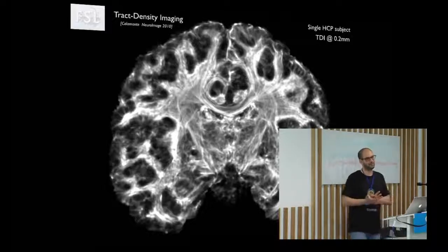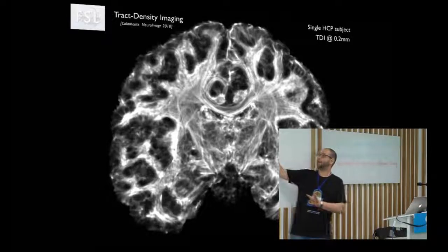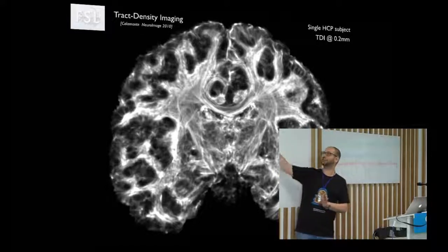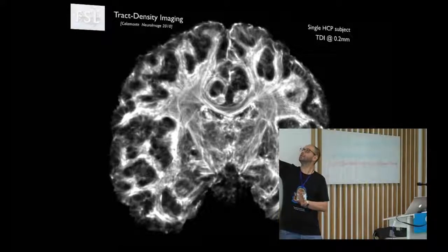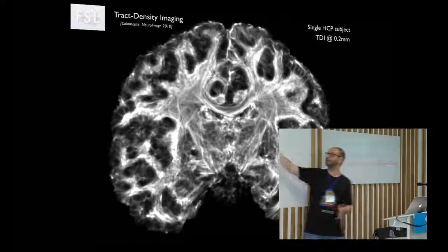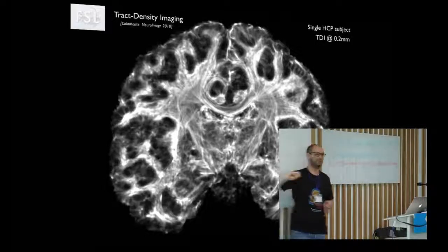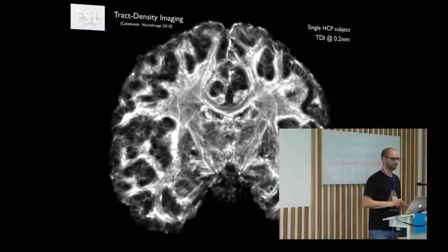But even if you do this rather simple approach, it's going to act like a sort of super resolution algorithm. Given exactly the same structural connectivity mapping that you performed at the beginning, you start seeing the crossing of the white matter fibers at a much higher resolution, with the corticospinal tract nicely crossing the callosal fibers, which are fanning to the contralateral hemisphere, right?